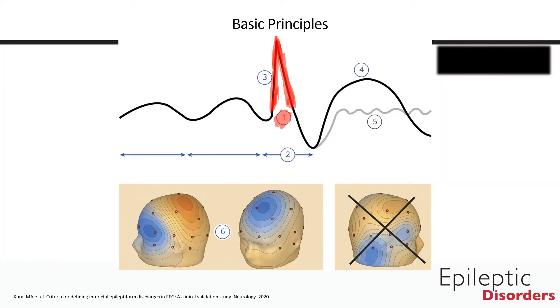The first criterion we will discuss is the morphology of the waveform in question. In order to be characterized as an epileptiform discharge, the waveform must have a di- or triphasic morphology with a sharp, spiky component, i.e., a pointed peak. In this diagram, the part of the waveform highlighted in red shows a diphasic wave with a sharp, spiky component, i.e., a pointed peak, which is consistent with the first criterion.